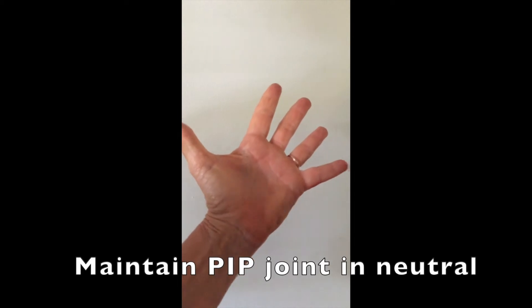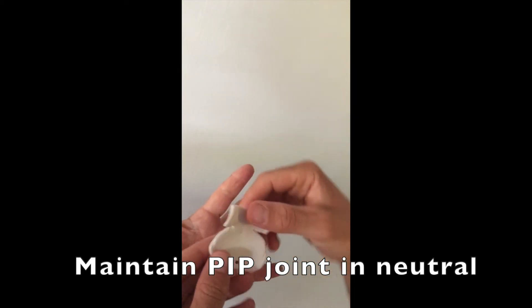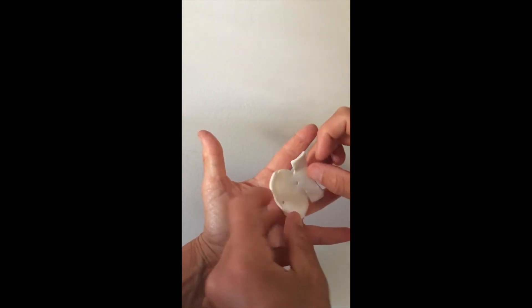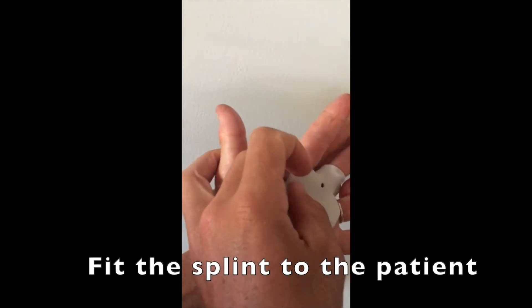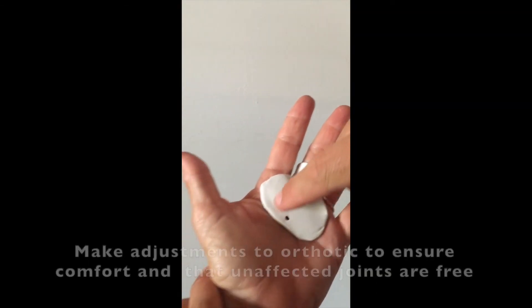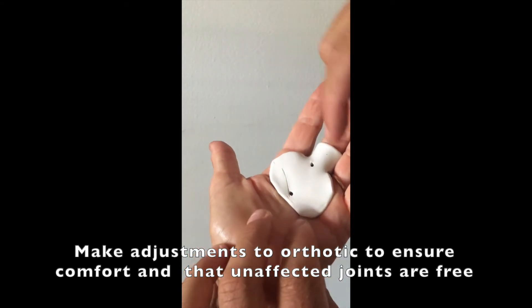We're going to do the middle finger here. Try to keep this as straight as you can — just like that. This part goes around the proximal phalanx here.